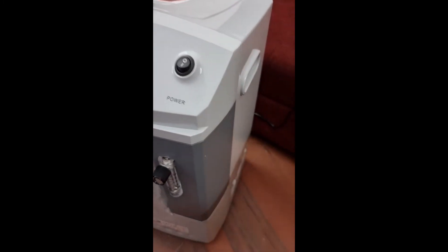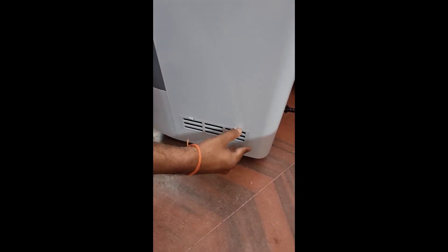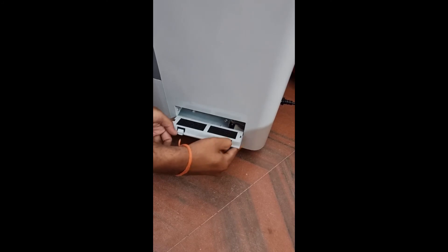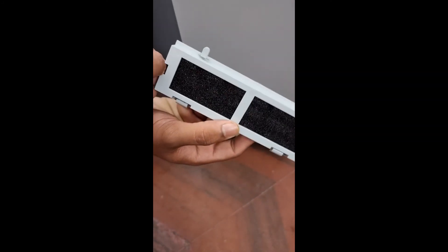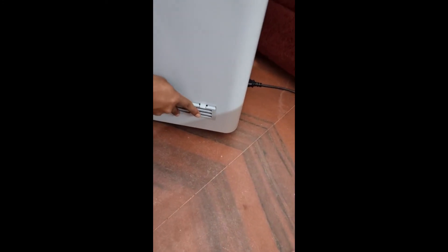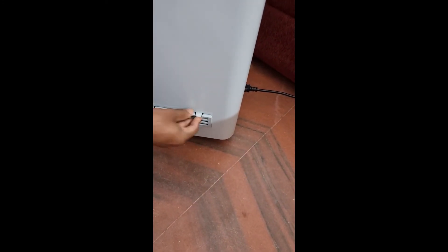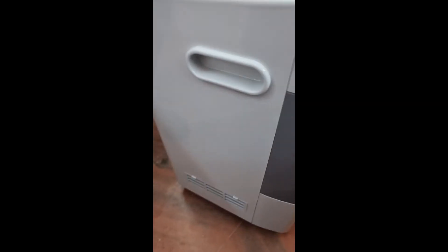Now we will show you how to clean the filters and put them back — this should be done every week. Press the compartment with two fingers to access the primary filters, pull them outside, dust them, and put them back. The same applies to the cabinet on the other end. There is also one more filter on the left side — same procedure: take it out, dust it, and put it back.